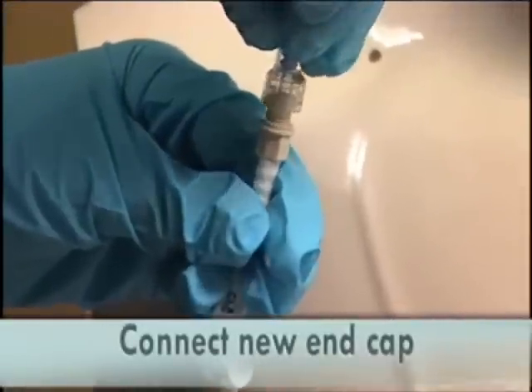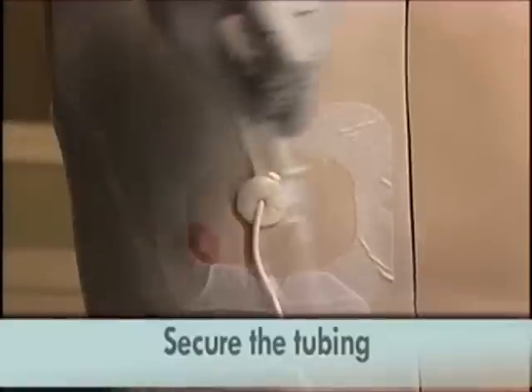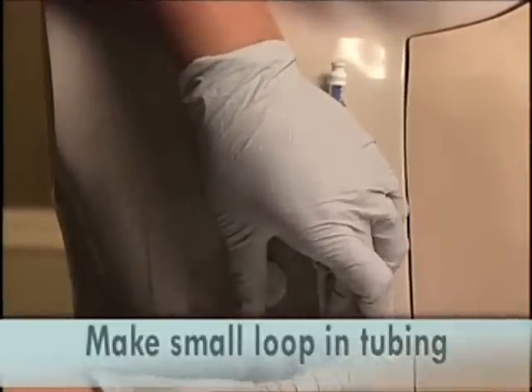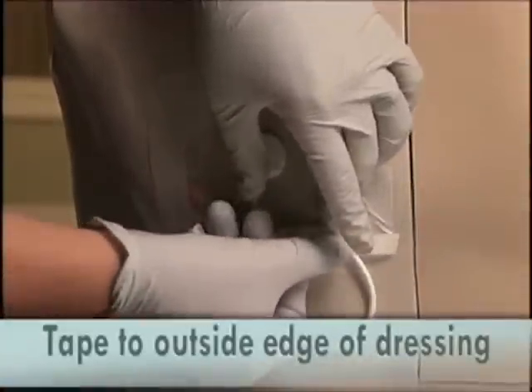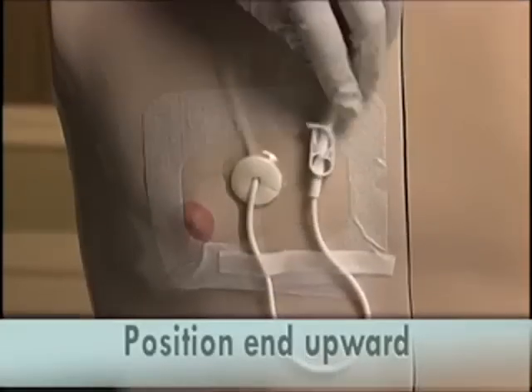Connect the new end cap securely. Affix the tubing to your skin. Make a U-loop with the catheter and tape it securely to the outside of your dressing with the end cap facing upwards.